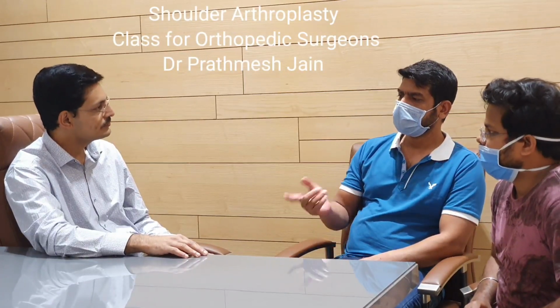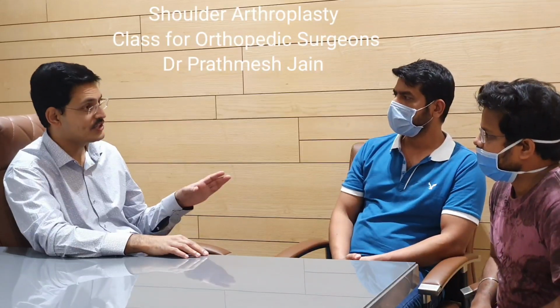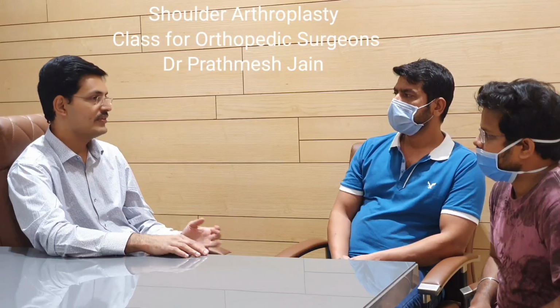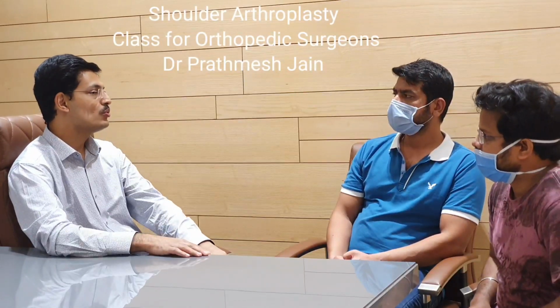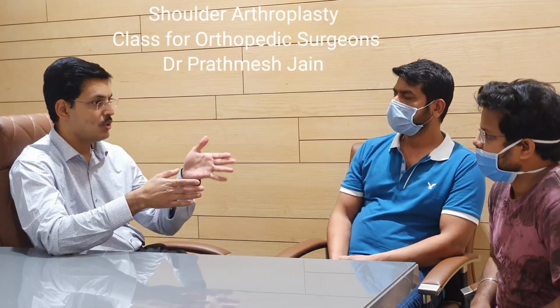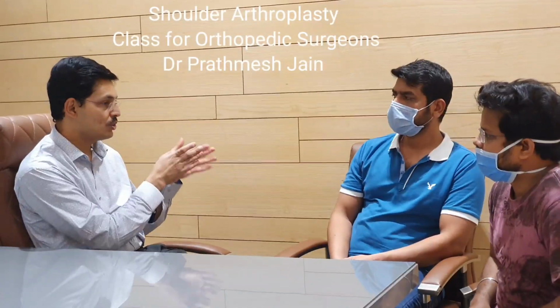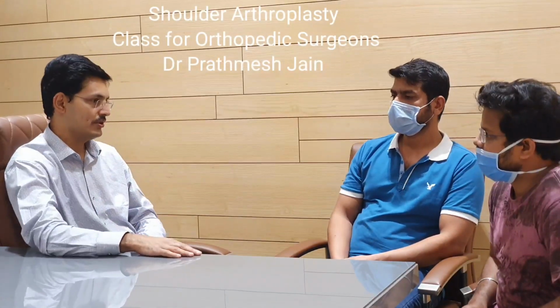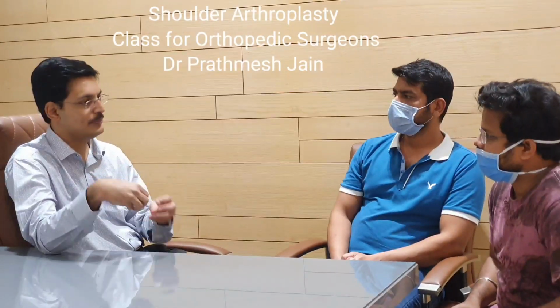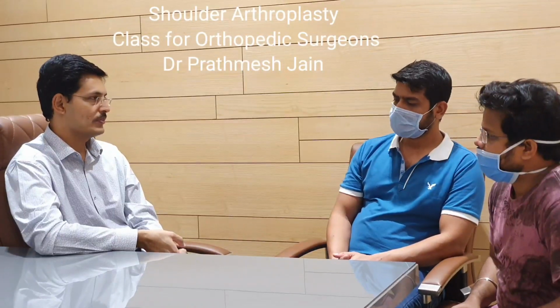In case of reverse shoulder, can the patient continue with overhead activities? Yes, very good function actually. With reverse shoulder, the patient will get very good function, including overhead activities, and all the activities that you want to do are better preserved. That's why, as I told you, the ratio of hemi versus reverse is increasing, and the ratio of total versus reverse is increasing a lot. In my practice, most of the time these days, the final answer will be a reverse shoulder prosthesis as compared to a total shoulder prosthesis.